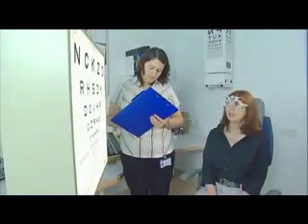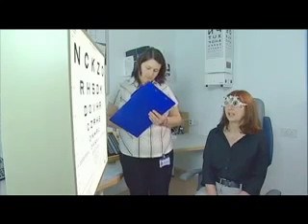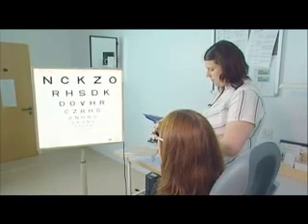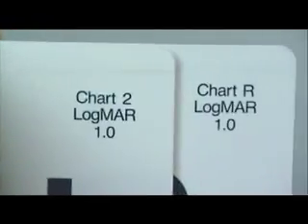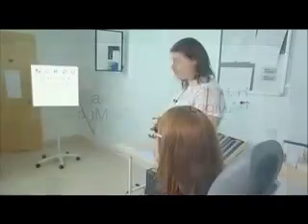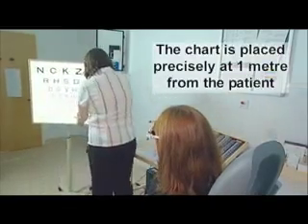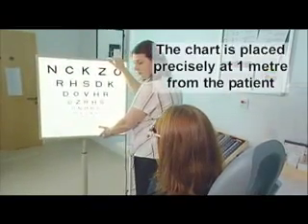Testing at one metre is required if the patient reads fewer than 20 letters correctly with either eye. Both eyes must be tested first at four metres before testing at one metre. The right eye and left eye charts are used as before, and the patient must remain seated for the one metre test, with the distance of the head from the chart carefully monitored and maintained throughout.